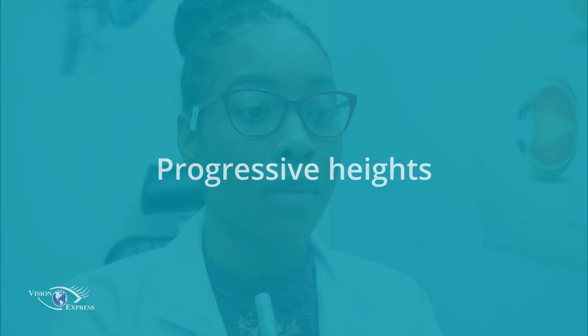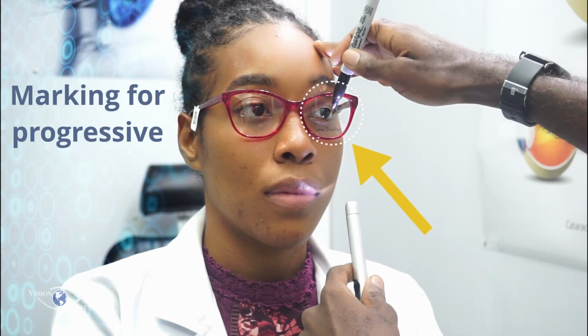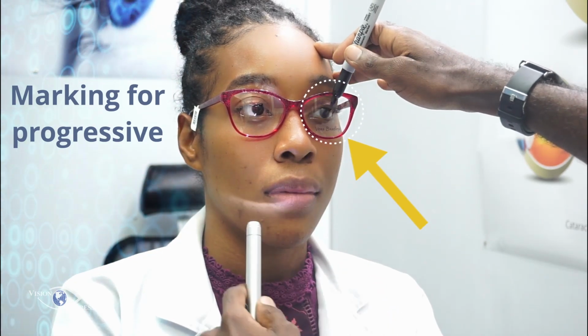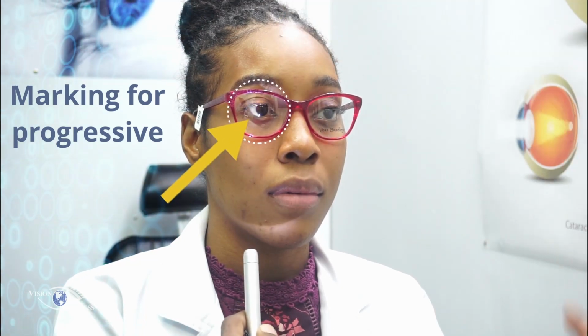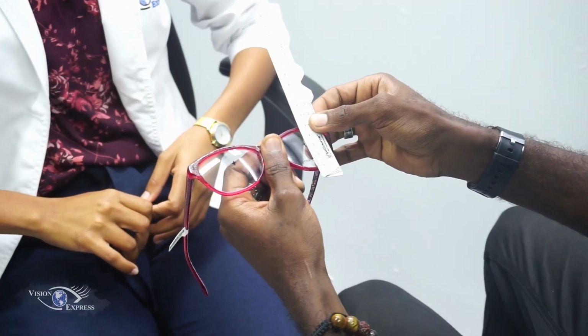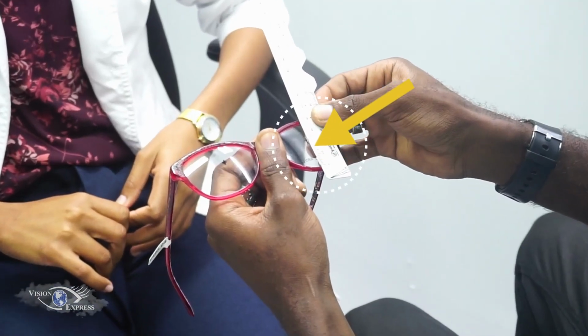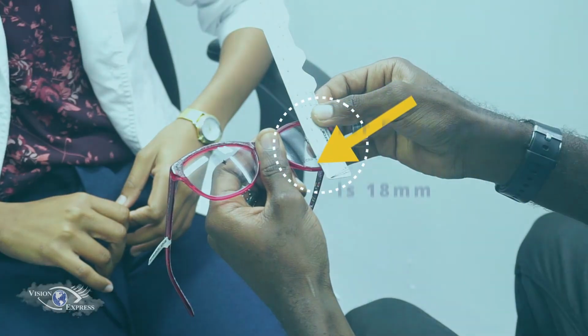Progressive heights. Ask the patient to put on the frames where they feel most comfortable. Just like the PD, have him or her look at your left eye. Using a thin point marker, mark the point where the center of the pupil lies. As the patient looks at your right eye, mark the point where the left pupil lies. Measure from these points to the edge of the frame. Your minimum height for progressive should be 18 millimeters.